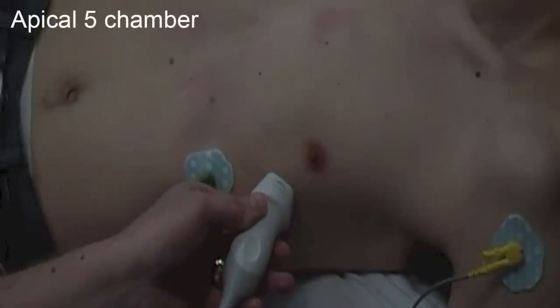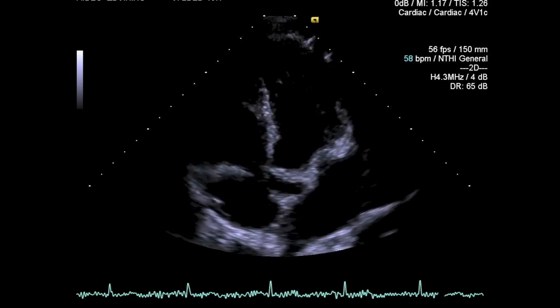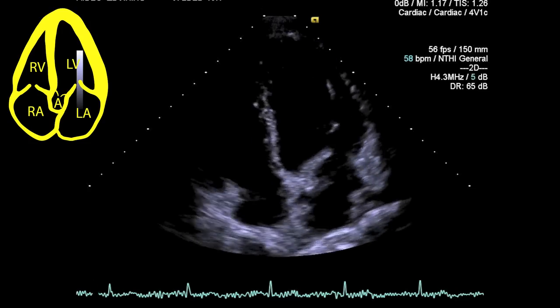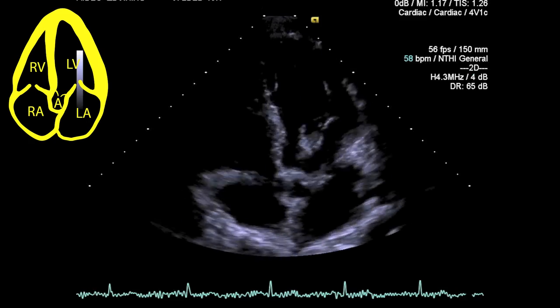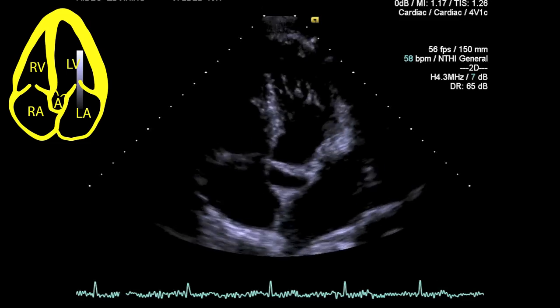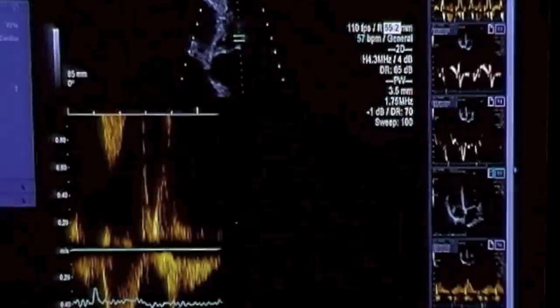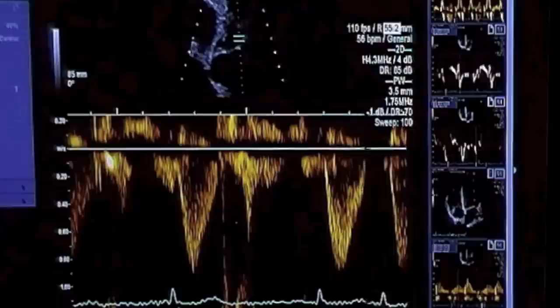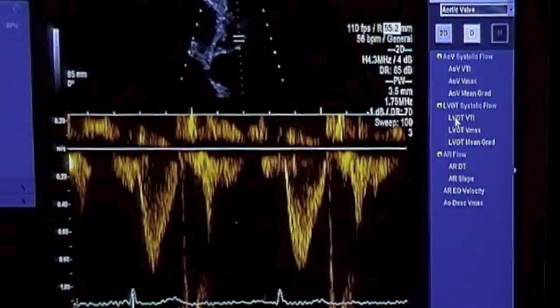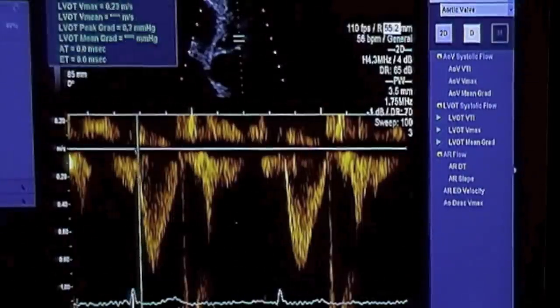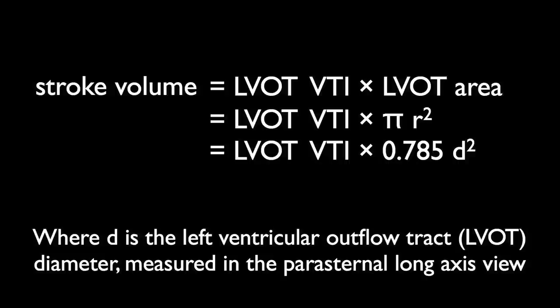The apical five chamber view is achieved by tilting the probe more anteriorly so that the ultrasound beam is directed towards the aortic valve, which is an anterior structure within the thorax. By placing a pulse wave Doppler in the left ventricular outflow tract, you can measure the velocity time integral by tracing the area under the curve. You can then calculate the stroke volume by applying the area of the left ventricular outflow tract measured in your parasternal long axis.